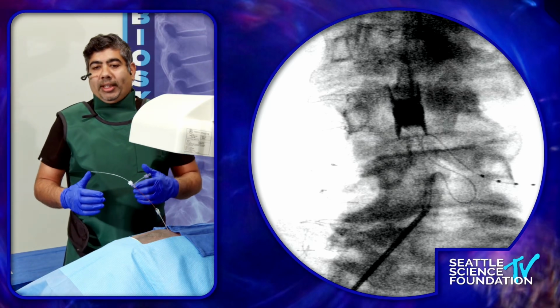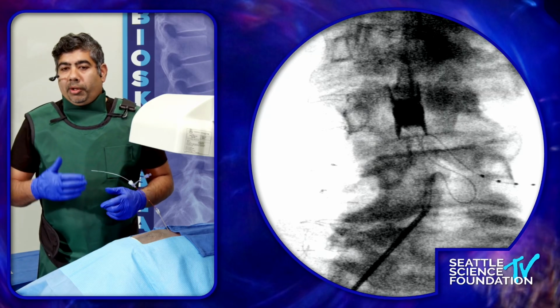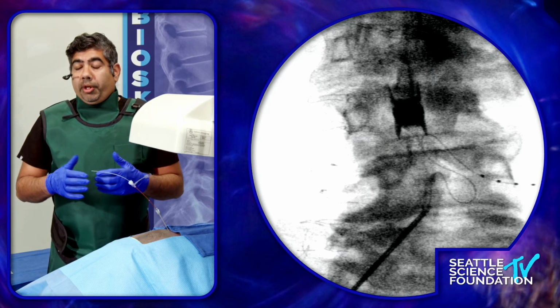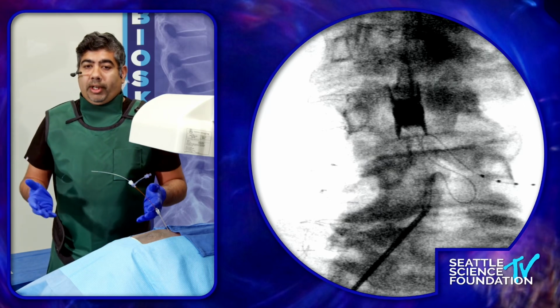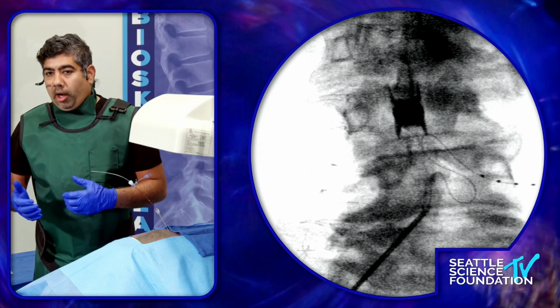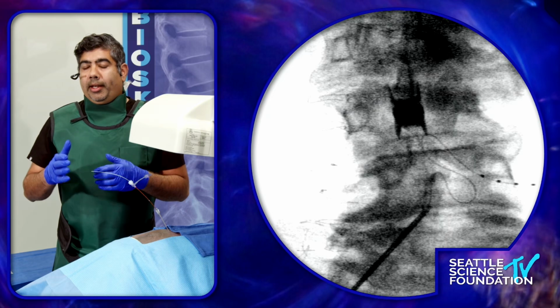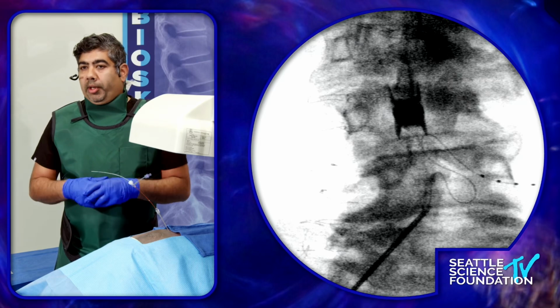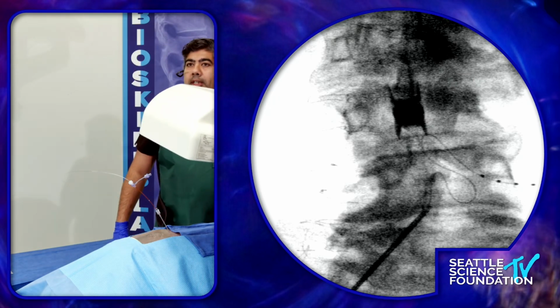So I think a lot of this is basically following the steps very ritually, so that you don't go wrong. The problem is if you actually make a mistake in step number 2, you don't realize that until step number 10, where you have to take everything out and do it all over again. Now, we can do a lateral X-ray right now. For people who are starting off, I recommend doing a lateral X-ray a little bit earlier on, when you have first parked the contacts, so that you can get an idea whether you are crossing the anterior border or the posterior border of the vertebral body, which is a ventral placement of the lead. So let's do a lateral, Steve, and then have a look at the contacts.